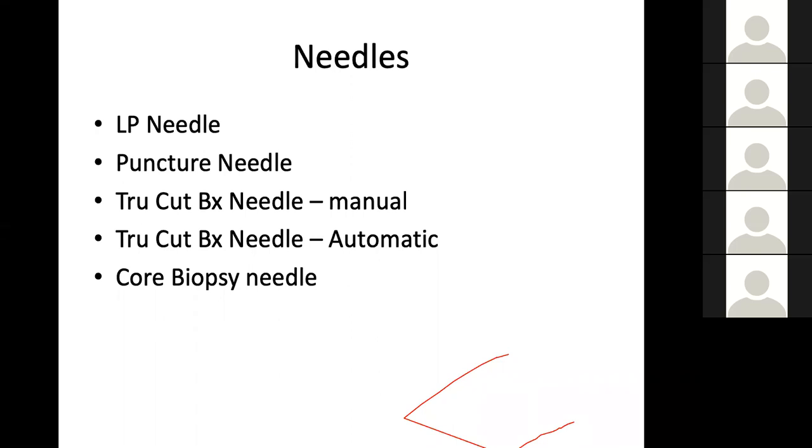So please remember this. If you have a needle and you make the distal tip blunt, it becomes a cannula. If you have a needle and you fill the lumen with metal, it becomes a stylet. So a needle is something which is hollow and has a sharp tip.